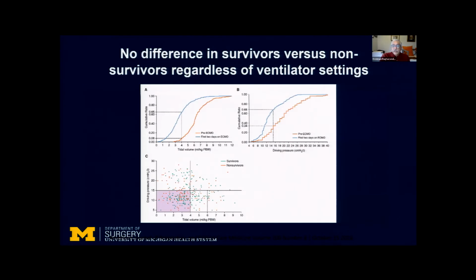Going on to further examining these patients, you can see that as soon as ECMO was inserted, both the driving pressure as well as the tidal volume... So driving pressure is nothing but the difference between the plateau pressure and PEEP, and the tidal volume, there was zero difference in mortality, because after a certain stage, you can see that both the survival curves started merging.